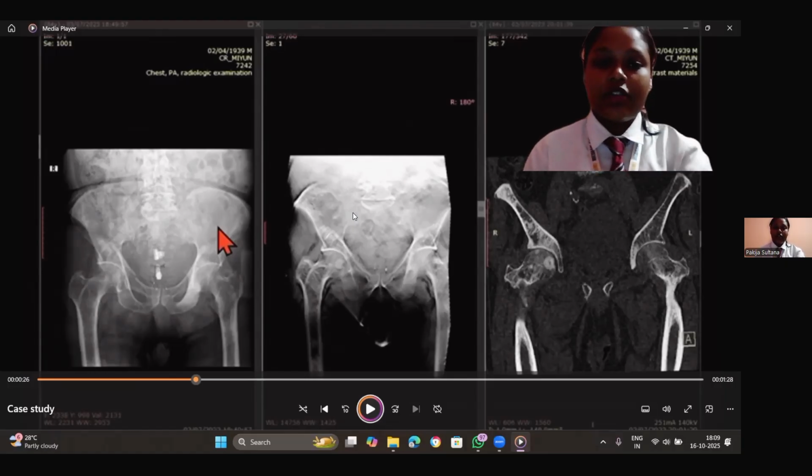According to studies, many missed fractures are due to limitations in conventional imaging sensitivity. The challenge is to detect fractures early, localize them precisely, and reduce radiation exposure, especially in the elderly patient who is most radiation affected.